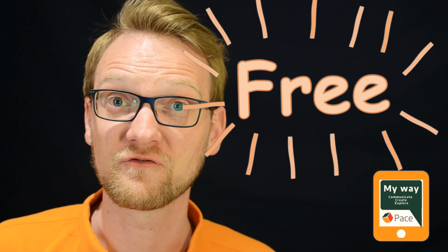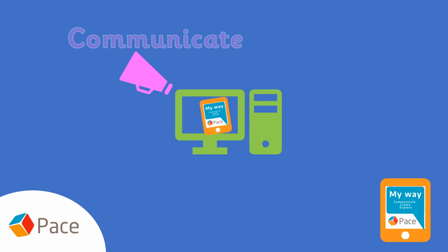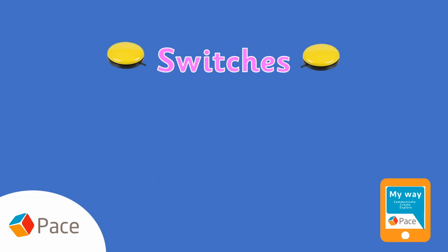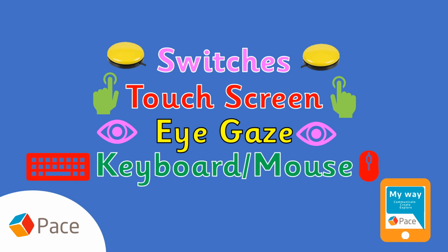This means that other clever software engineers can tinker with The Pace My Way and make it even better, and you, the user, can have it for free. The Pace My Way turns your computer into a bespoke speech output device that is holistically accessible and promotes communication, creativity, and exploration. It is designed for people with disabilities who access computers and communication aids via switches, touchscreen, EyeGaze, or use traditional tools like a keyboard, joystick, or a mouse.